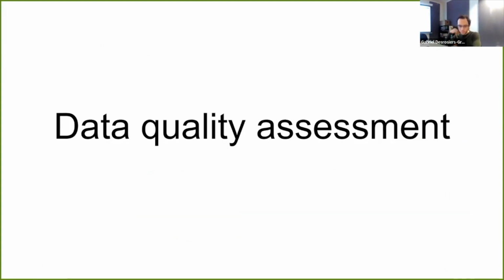So this last stage, I will disclaim, is maybe the less standard step or innovation in the pipeline. All of the previous steps I've covered are pretty standard in fMRI software. They allow you to do minimal image registration, maybe some confound correction options and some basic analyses. But often, they don't include standards for exploring data quality in detail.